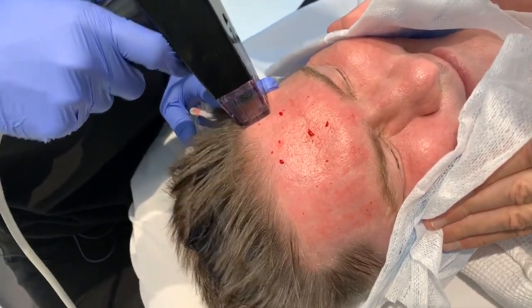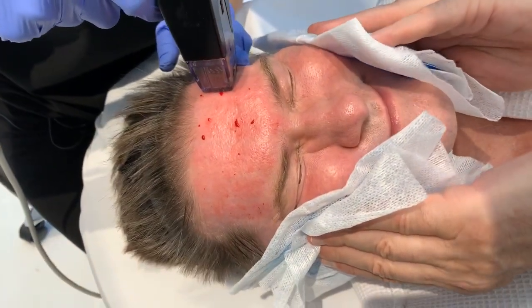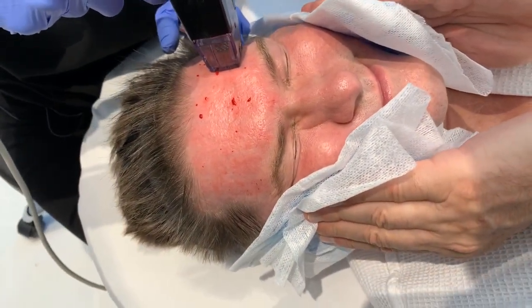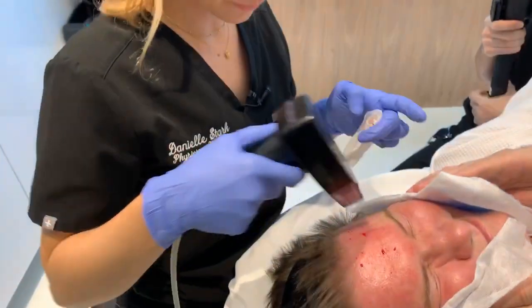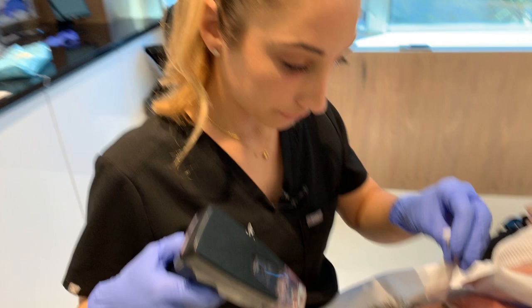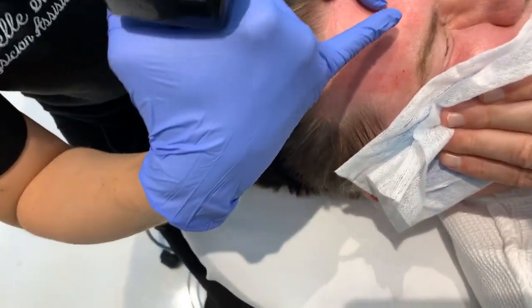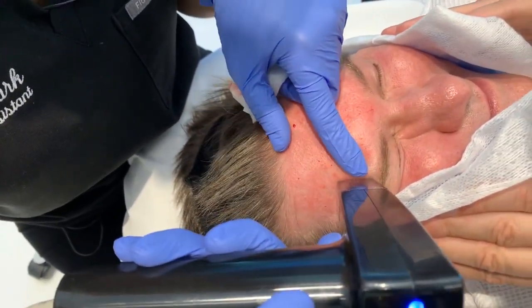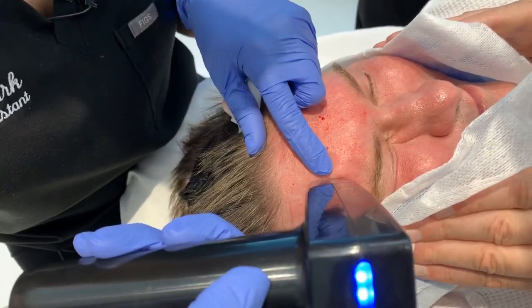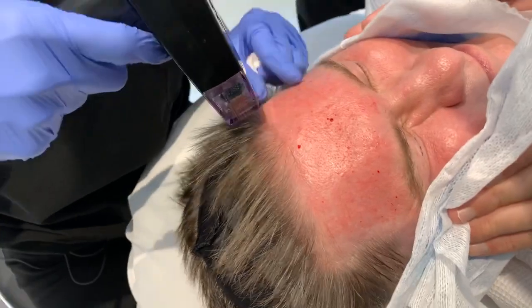So I always said up top, the forehead is the most uncomfortable, and then we'll move down to the cheeks. And at that point, we can also adjust our depth to be a little bit deeper in the skin. Doing okay? Yes, ma'am. So you can see here, I've had some pink develop. And there's just one little outline of some missed spots, so I'm going to go back here. Good. Continue our way across.